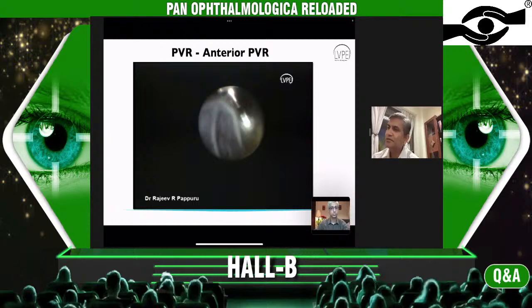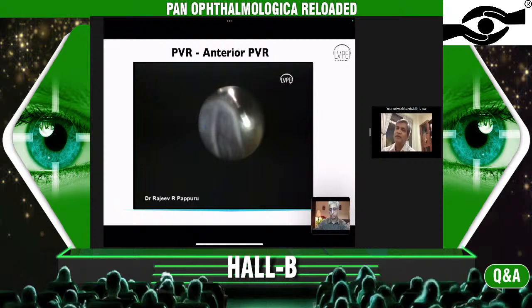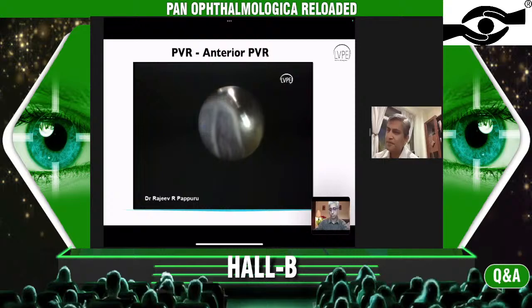We will start causing subretinal air when we start settling the retina, and cause tears in the retina when we try to forcefully attach it. The second thing is that identifying and removing this part will help in managing hypotony post-operatively in these cases, which is seen more often, mainly because these peripheral membranes cause damage to the ciliary body, causing long-term hypotony, and we will not be able to remove the oil from these patients.